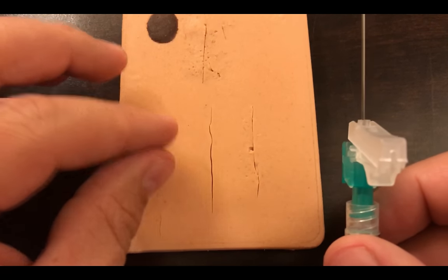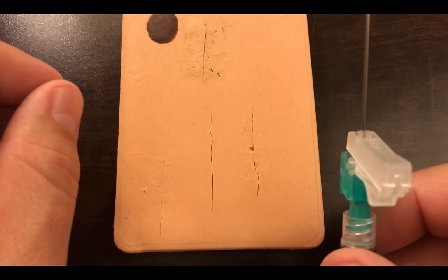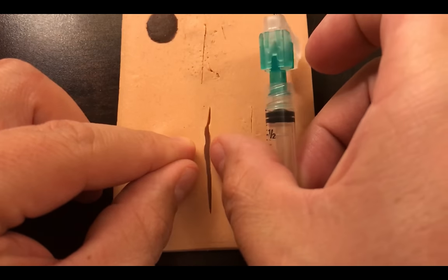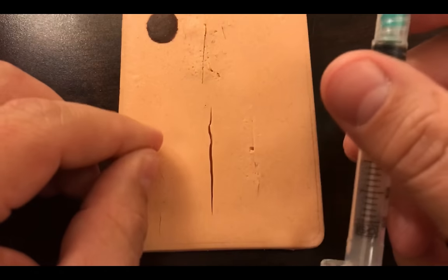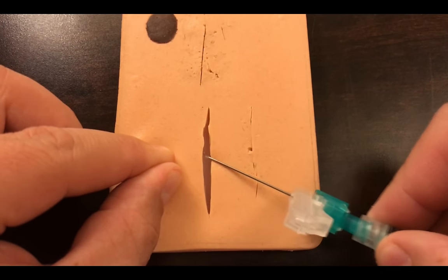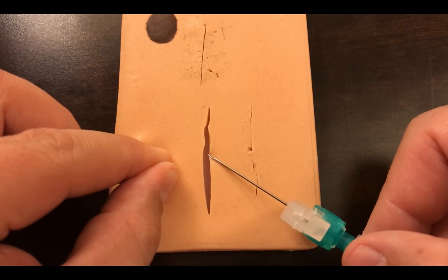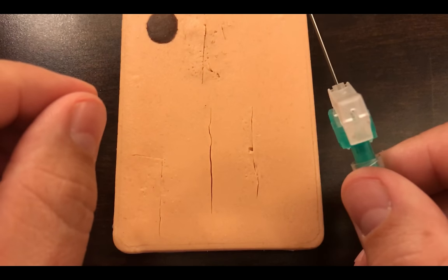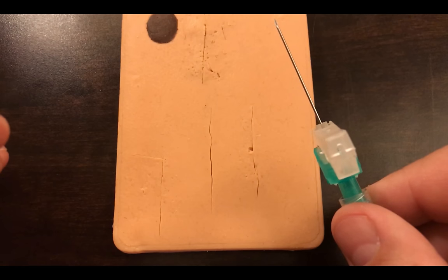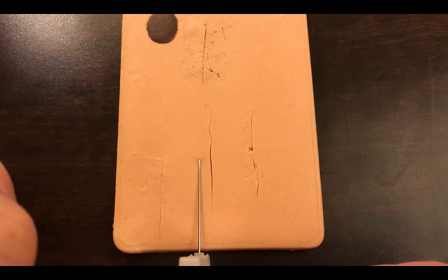We could do the same thing in the emergency room if it was a very clean laceration with little debris and not much concern about infection. But if it's a dirty laceration — a lot of debris, gravel, grass — I'm not going to stick a needle into the laceration, because I'd be driving contaminants further into the skin and potentially increasing infection risk. Instead, I'll clean the edges with an antiseptic like betadine and penetrate the skin outside of the laceration.